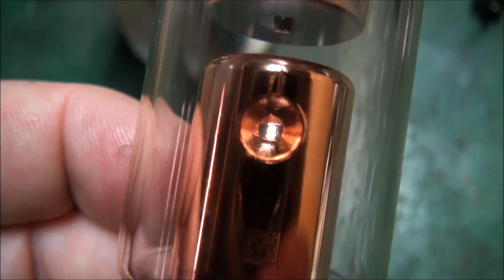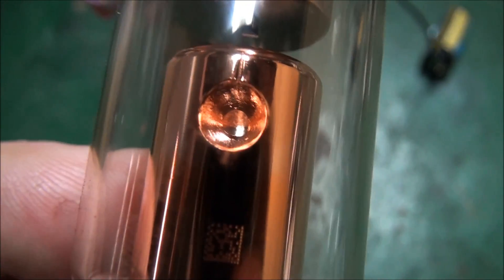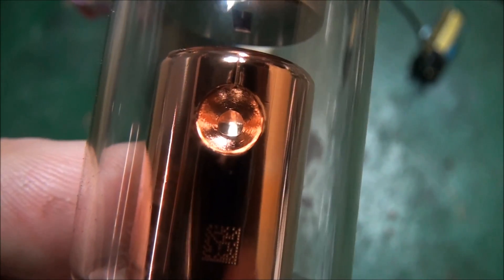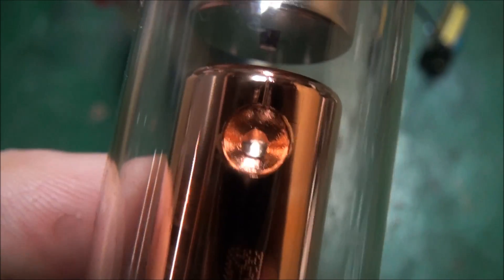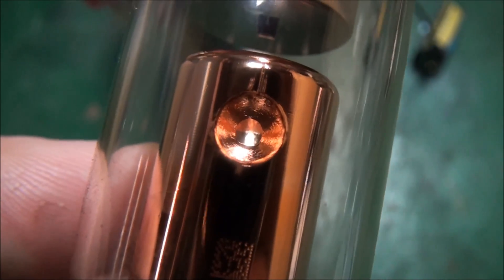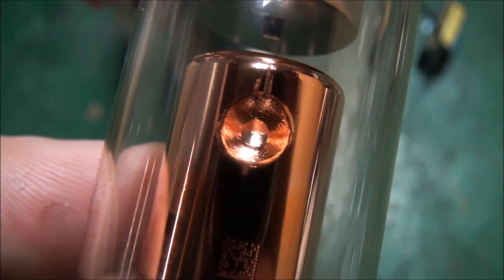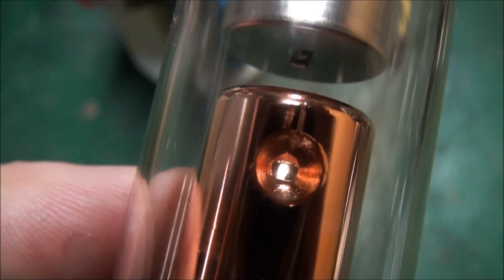You can see the difference — this tube here has what they call the target, which is embedded in a copper heat sink and has a small aperture which helps collimate the beam. It also gives a much finer focal point, which results in higher resolution, high quality x-rays.